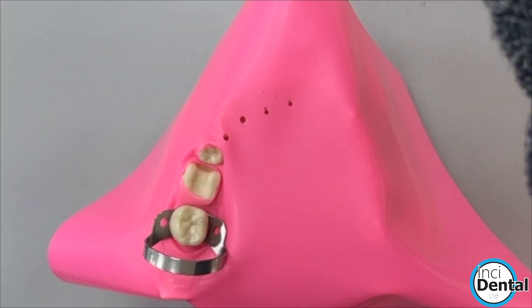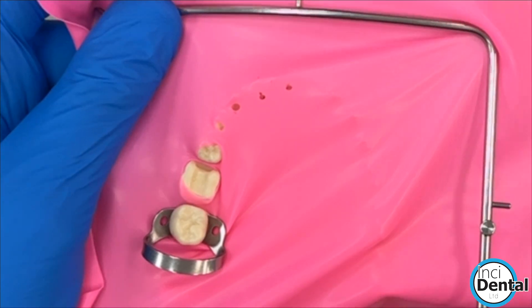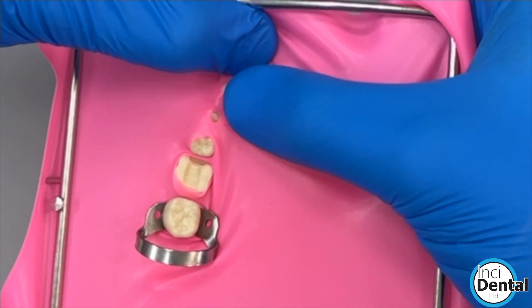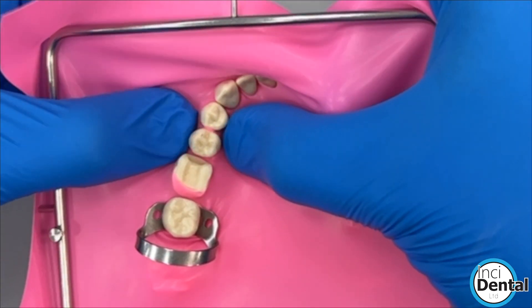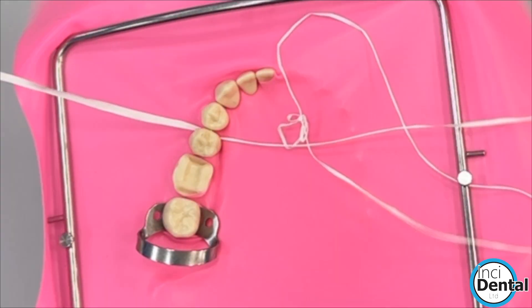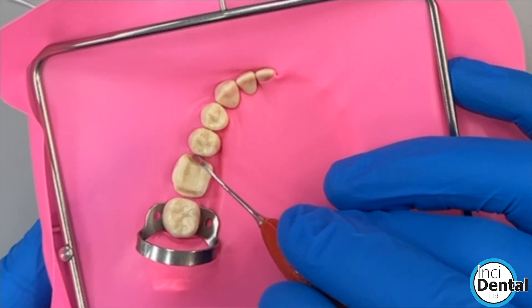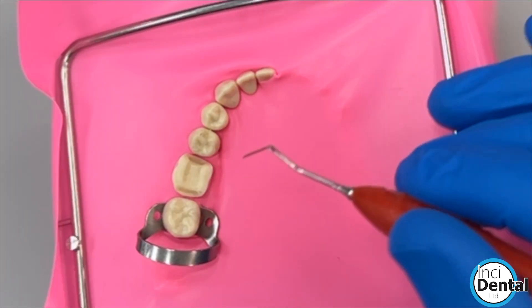Usually once I'm on, I'll put it in the frame and then work these through the contacts. Try and get something at the front first — it'll help pin it down. Usually that's the easiest and then you can work through the contact. Sometimes it needs a little bit of floss. It's a little bit easier on a typodont than it is in the mouth, but you'll see we can get the overlay to isolate reasonably easily. In the mouth, what you find often is it starts to ride up the tooth.